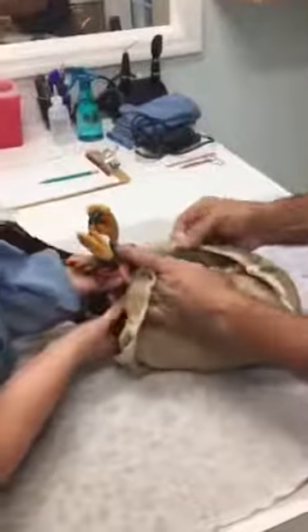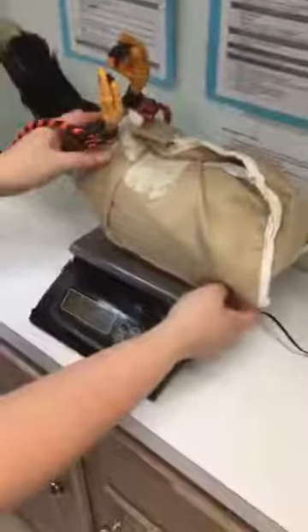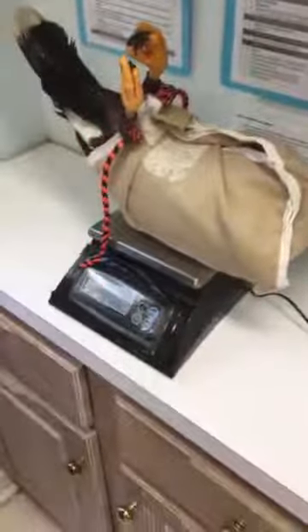We take care of any maintenance like coping the beak, and we can talk about that in a minute. First thing first, we wrap them up like a burrito and put them on a scale so we can get their weight.